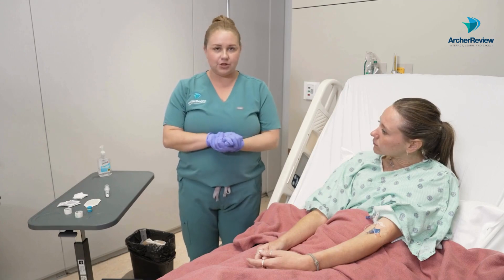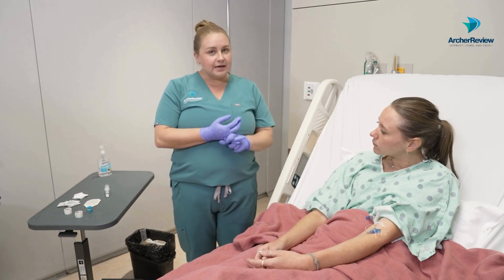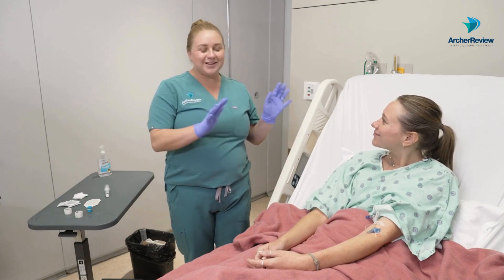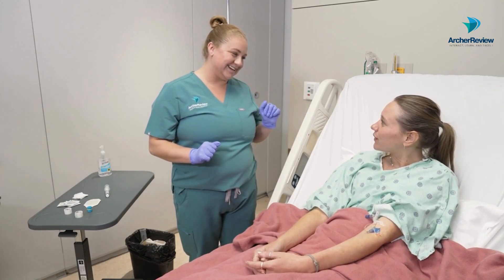As always, before you come into the room, we're going to verify our client's order and verify their identity with two different ID checks. So Ms. Caffrey, can you tell me your name and birthday so I can check your identity? Annie Caffrey, January 1st, 1998.